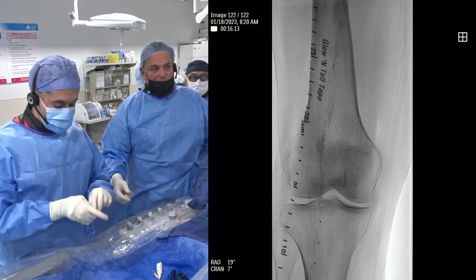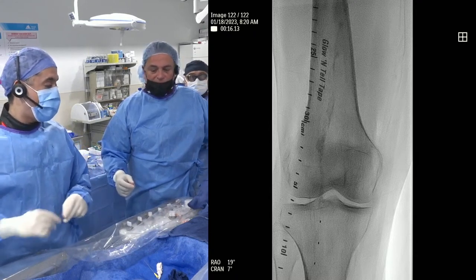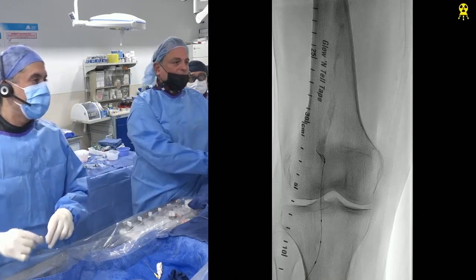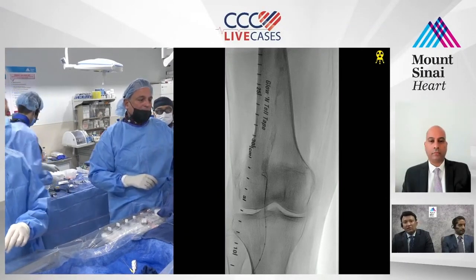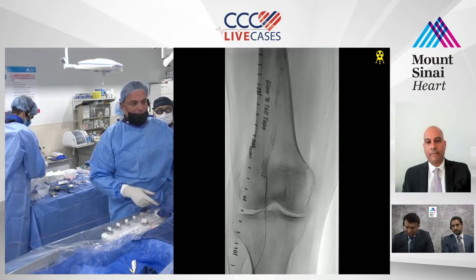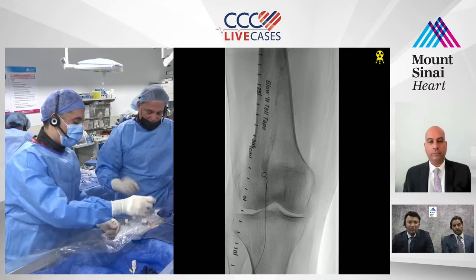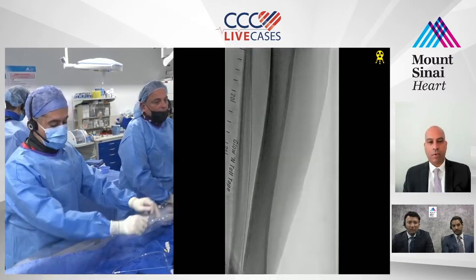I'm going to upgrade here to a 5/6 slender. I'm going to put the Terumo Navicross in, cross it, and then I agree, PK, I think the 80 is pretty reasonable in size. I don't think a 5/6 slender is going to make a big difference to that 80. I mean, it may. It's always a worry, right? The 5/6 slender is a good size. It can be placed on an 018 wire, so we're going with an 018 Command here, right? Yeah. So good strength wire. Just one point to keep in mind about accessing this pedal vessel.